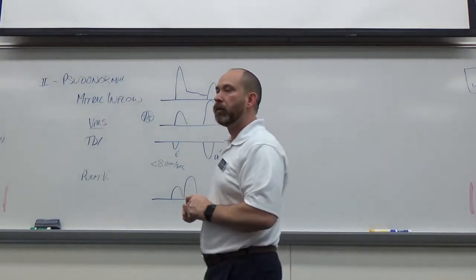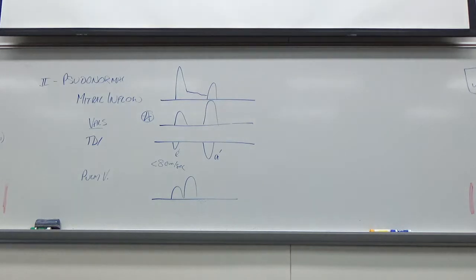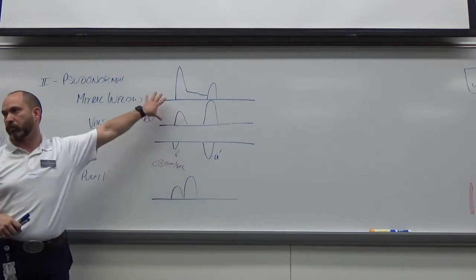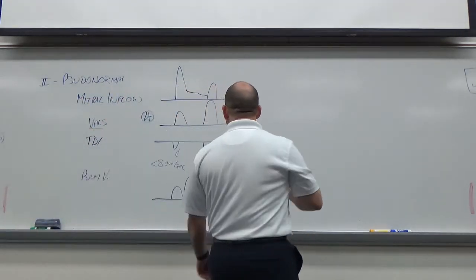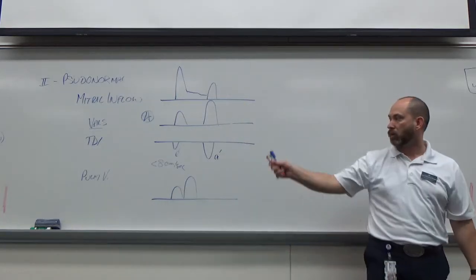I was just going to say, I don't think there's any numbers as far as A duration in the chart in the slideshow. Do you want us to know those? No, I'm just going to throw them out there for numbers right now, but again, you can tell everything that's going on almost solely based on the pictures right now. Okay? Some numbers will be important. Again, these EA ratios are important. It's that reversal that we're looking for that's significant.